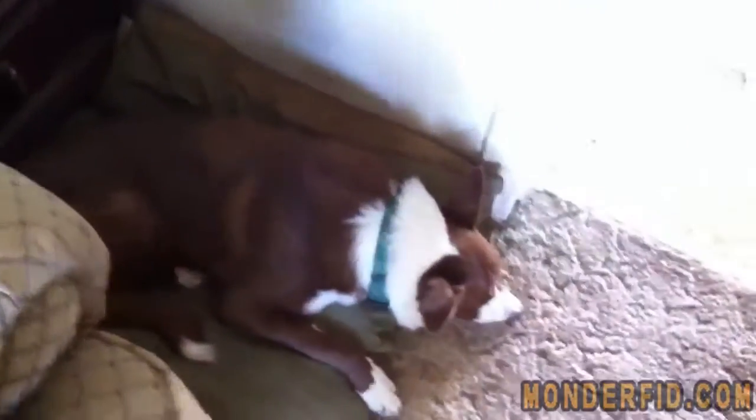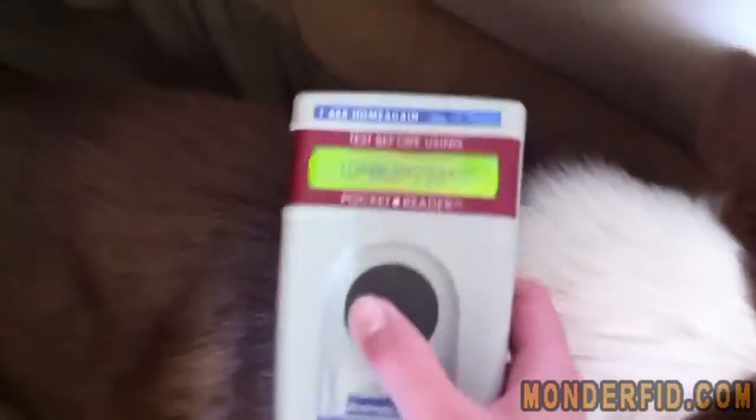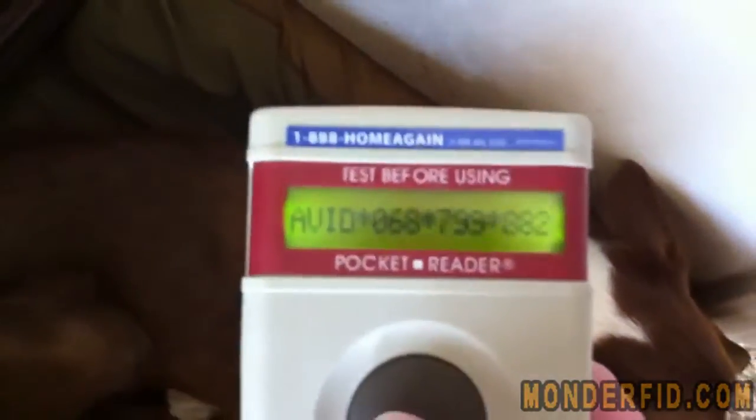I have a test subject. We're gonna hold down the button — it starts scanning. And we get close enough to him. Oh, it beeped. And there is Raider's AVID number.